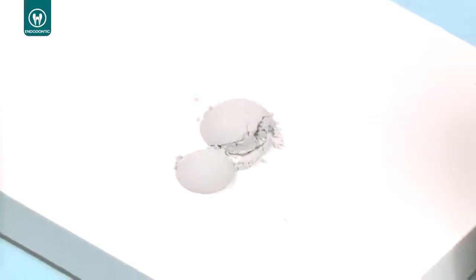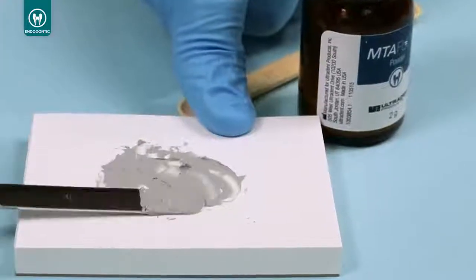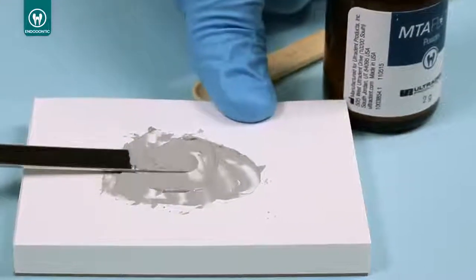The EndoEase MTA Flow ultrafine powder and proprietary gel medium creates a smooth consistency which stays in place and helps prevent washout.